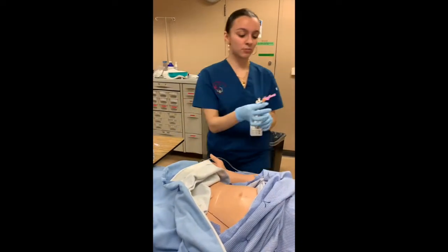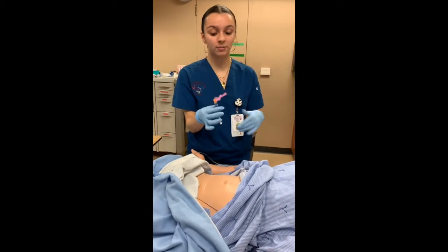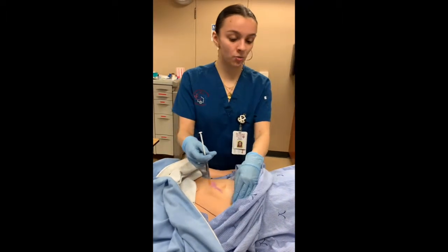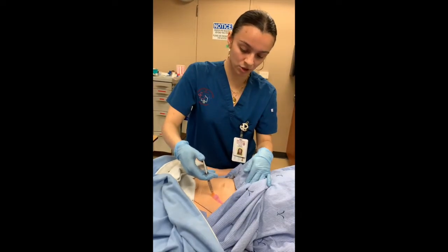And Mr. Mancini, I'm just going to be giving you your heparin injection now. I'm going to be doing it in your abdomen, okay? So just informing the patient. Okay, so I'm going to be going 1, 2, 3. Okay. And I'm just going to push the medication in.